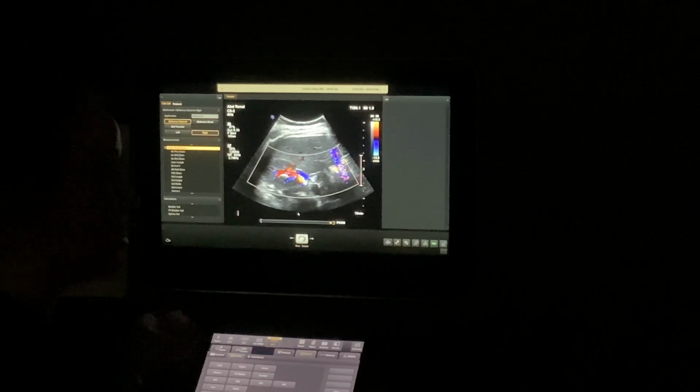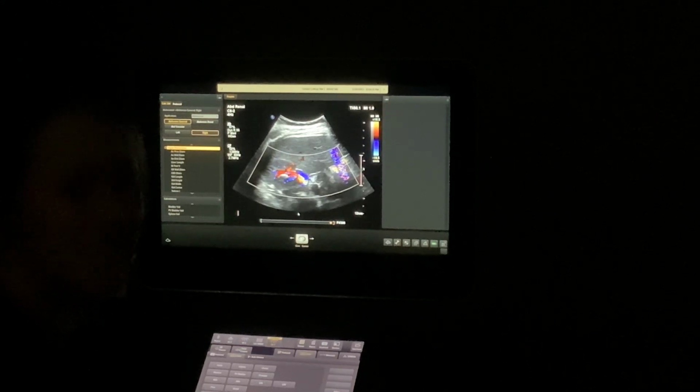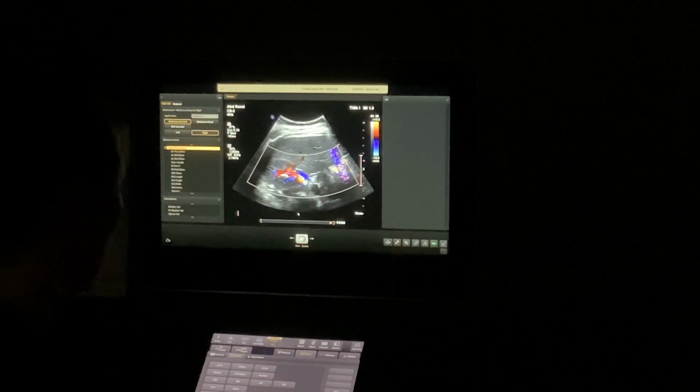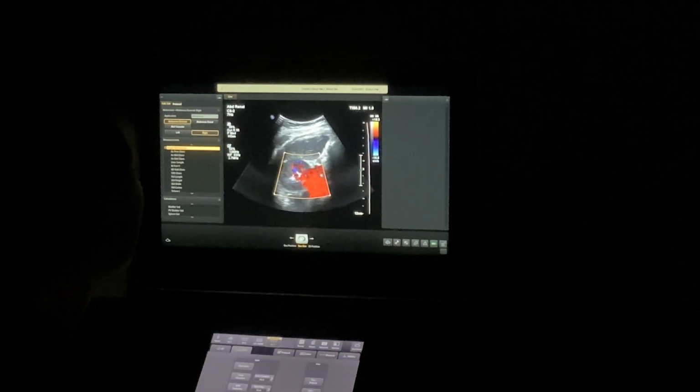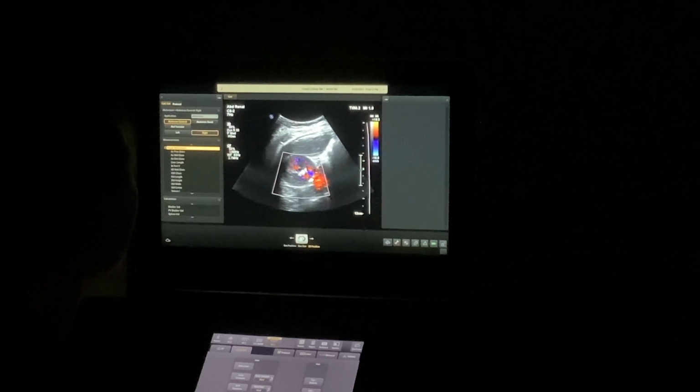So that's what your color picture should look like. What about that box? It's so big. My box is so big, Jody. Thank you. That was a test. Make your box smaller. And look how she centered it immediately. She put it in the center.